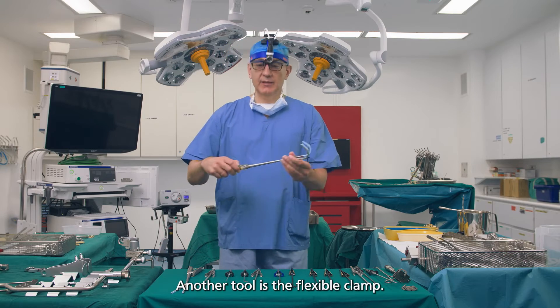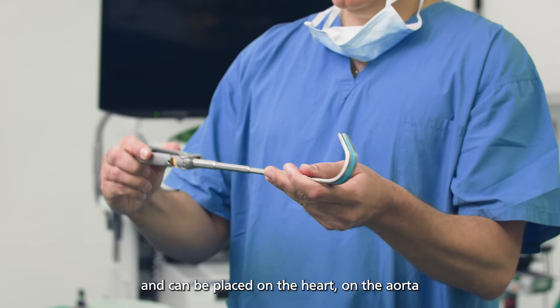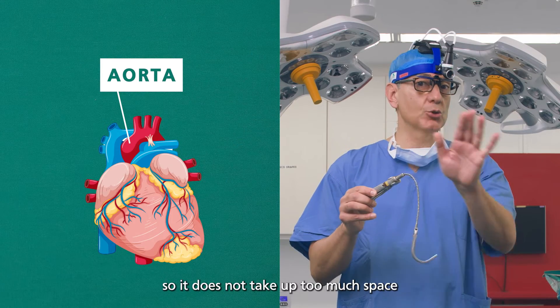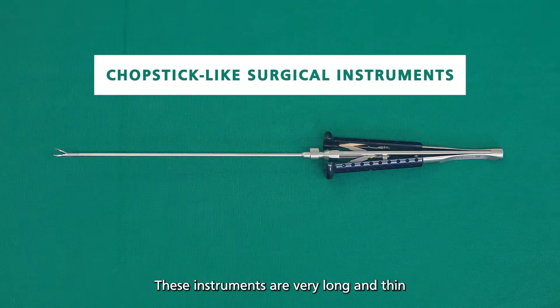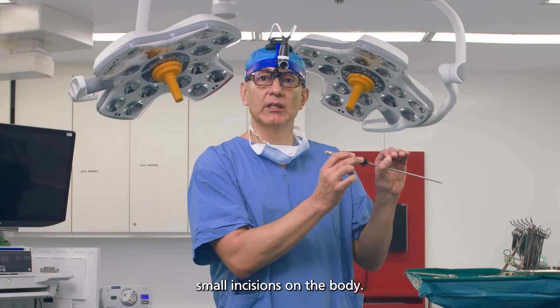Another tool is the flexible clamp. You see this clamp here can be bent, actually, and can be placed on the heart, on the aorta, but it is bendable, flexible — so it doesn't take too much space through the small incision. These instruments are very long and thin because they are supposed to pass through keyholes, small incisions of the body.